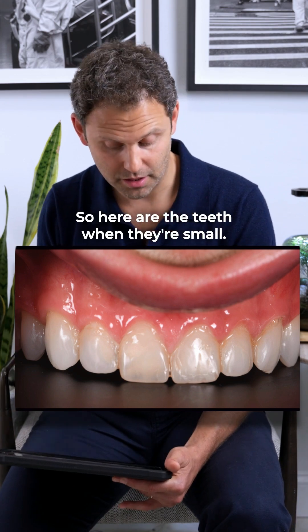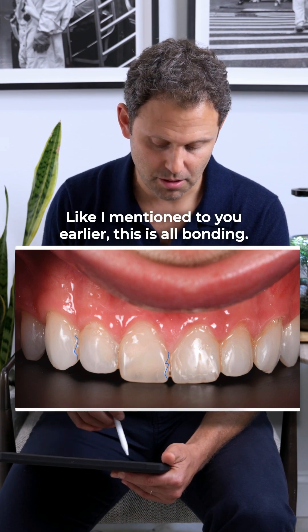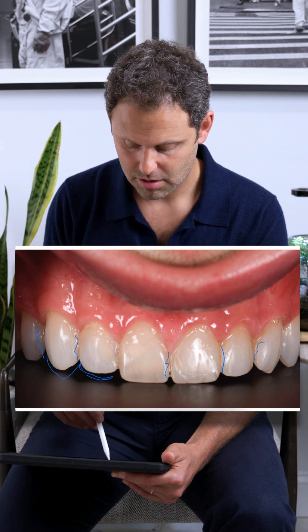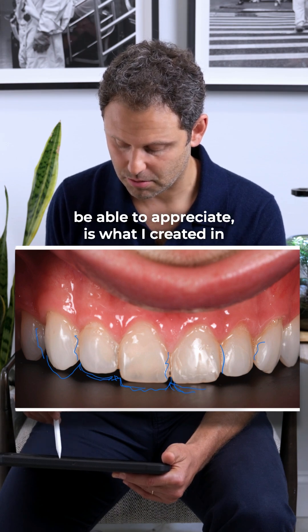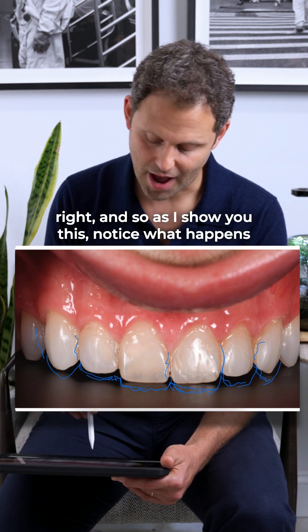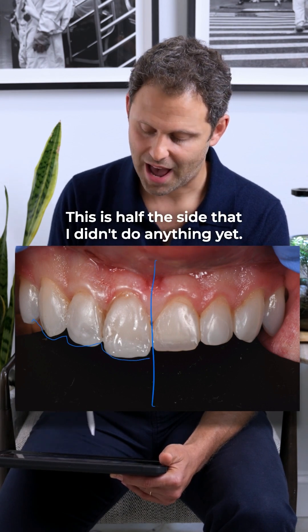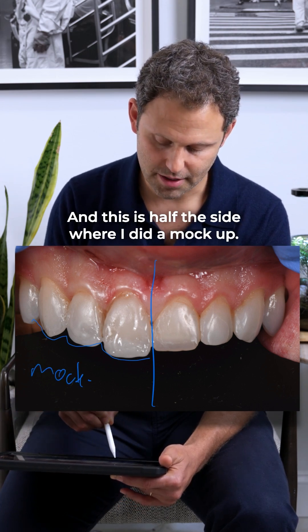Here are the teeth when they're small — no work has been done yet. As I mentioned, this is all bonding, and we need to clean all of that out. The goal is to make all of these teeth pretty much this target length going forward. What I created in the mouth is called an intraoral mock-up. This next slide shows you exactly what we created: length on this side, while the other half has not been touched yet.